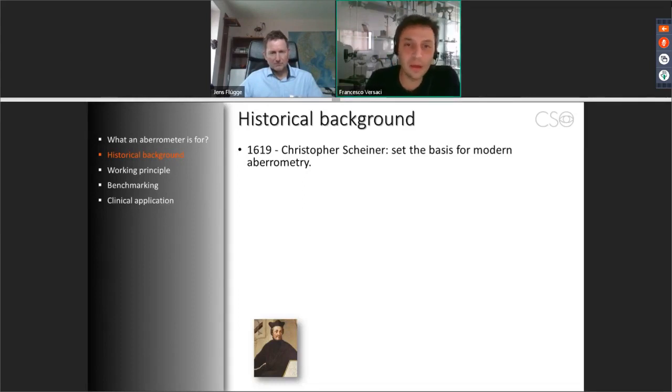If we want to give a historical background of such devices, we have to start from 1619 with Christopher Scheiner, who set the base for modern aberrometry. This German astronomer invented a kind of disc with two pinholes, and if the eye was aberrated, looking at a far light through those two pinholes, the light appeared as two distant lights.